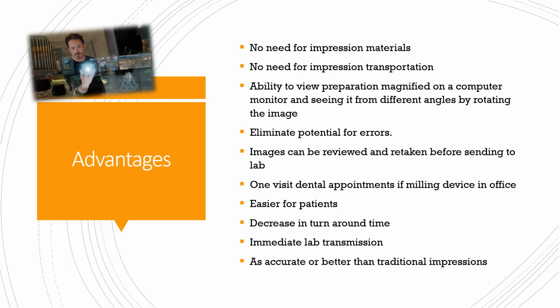Let's talk about the advantages. There are many advantages to digital impressions. It really creates a permanent 3D image that's in color. You could do a pre and a post operative model.